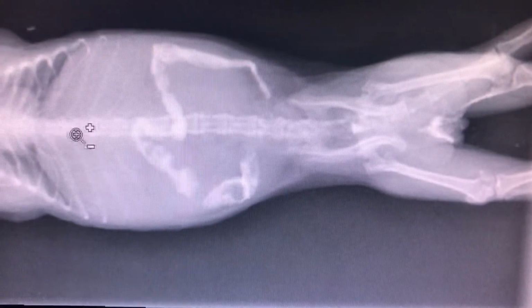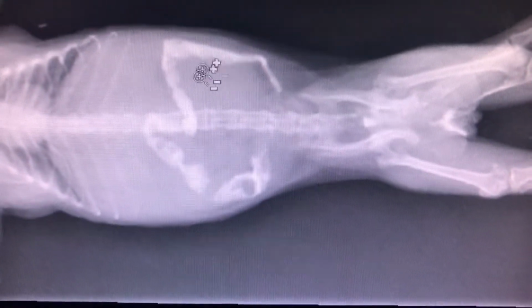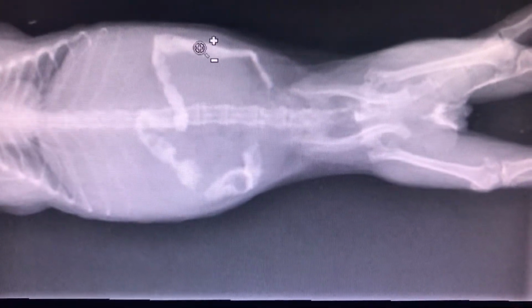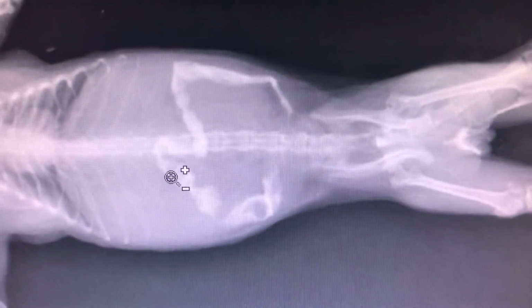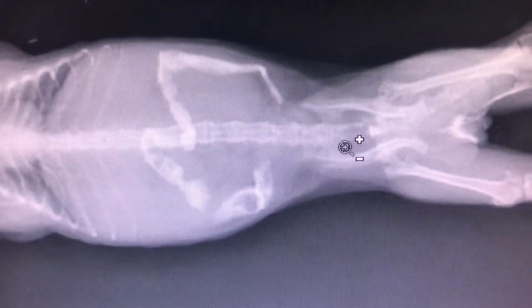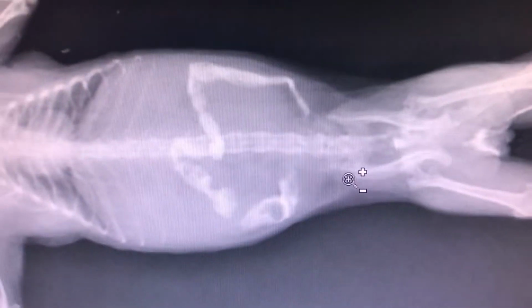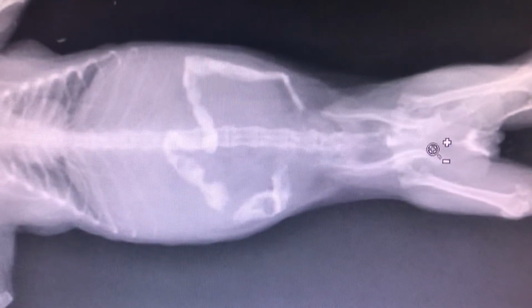I was afraid I was going to see something that would require surgery immediately. But anyway, the next step is the ultrasound. I'll get a chance to find a veterinarian here locally who'll help get an ultrasound of this area here, and then we'll take it from there. She was actually very good for me on this x-ray. On this one here, she was painful. On the lateral one, she sat still and was perfect. I thought I was going to have to sedate her. So she may do equally as well for an ultrasound. All right, that's it for now. Later.